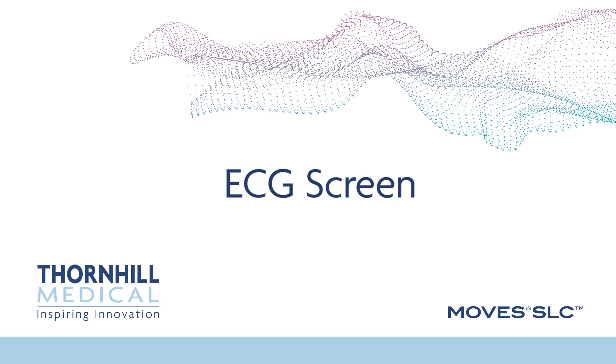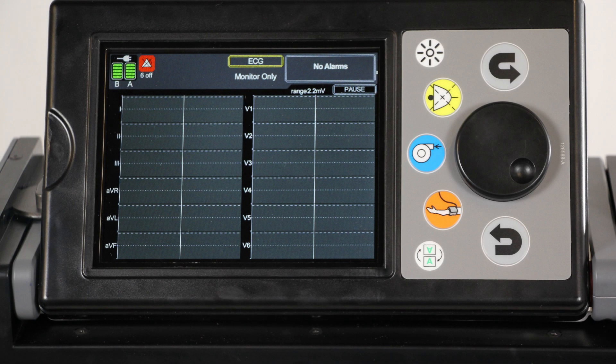ECG screen. The ECG screen is accessed from the screen select button. MOVES SLC uses a standard 12-lead ECG system for monitoring the heart and produces 12 ECG channels.